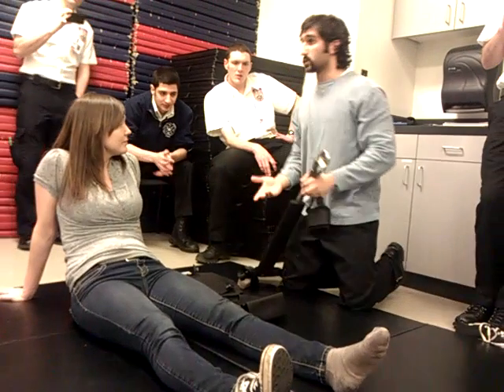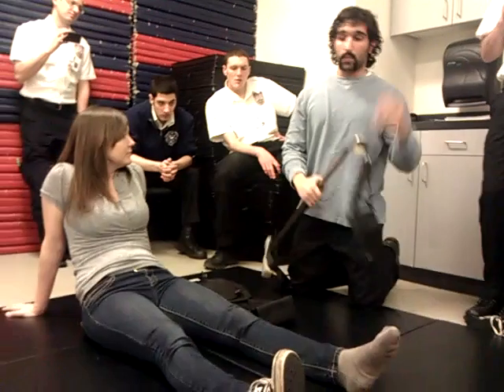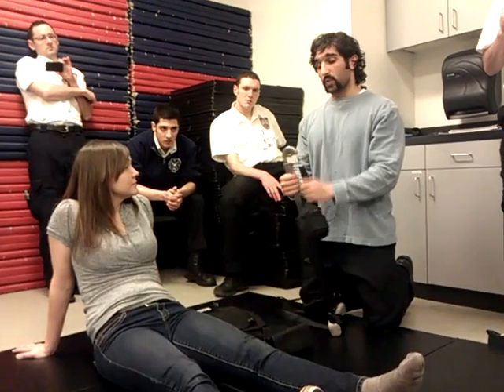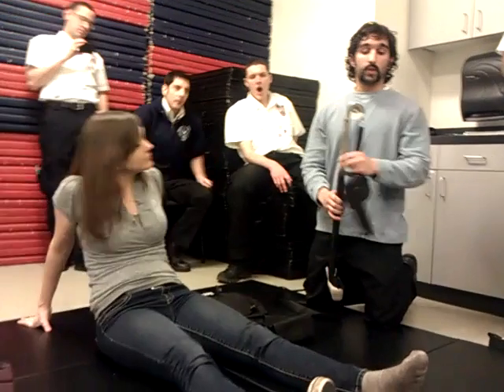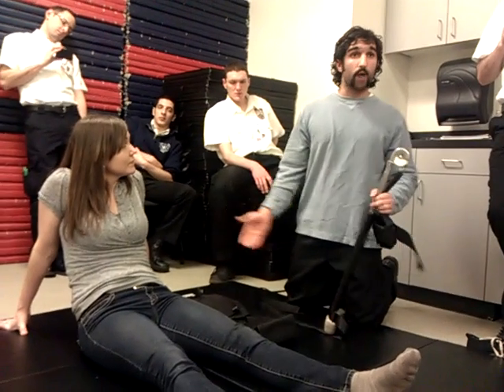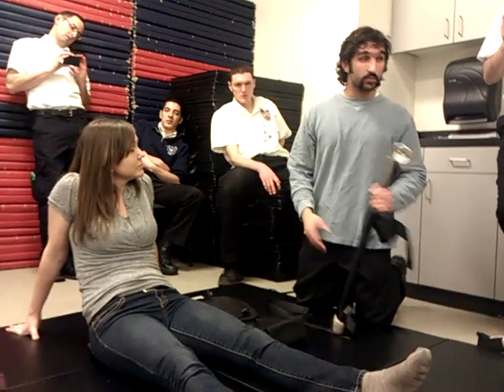Amount of weight that you're pulling traction on the patient, for the amount of mass that they weigh in pounds, right? Yes. In pounds, you're going to apply a tenth of that amount of traction. So if she weighs 100 pounds, you're going to apply 10 pounds of traction. Now the maximum is 15 pounds of traction. So if the person's 200 pounds, the maximum you're going to pull is 15 pounds of traction in this class.